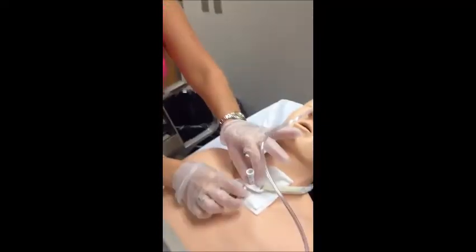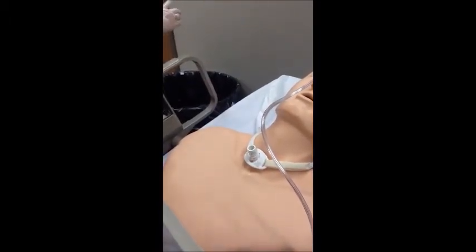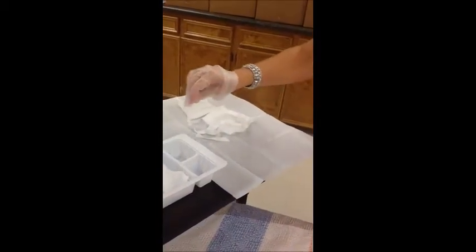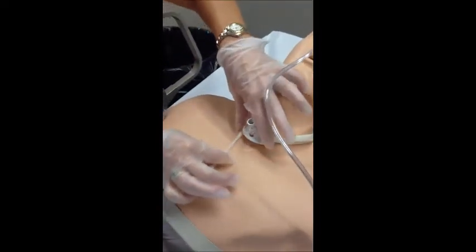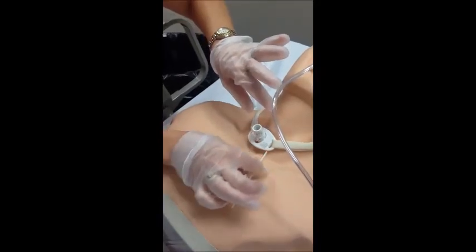I'm going to take this nasty, and it will be nasty, out, throw it in the wastebasket. And I'm going to take my Q-tips that were over here. I'm no longer sterile. I'm just relaxing. I just can clean like I need to. I'm going to put one in the peroxide. And I'm going to clean really good up under here. Stay close first and then work your way out.